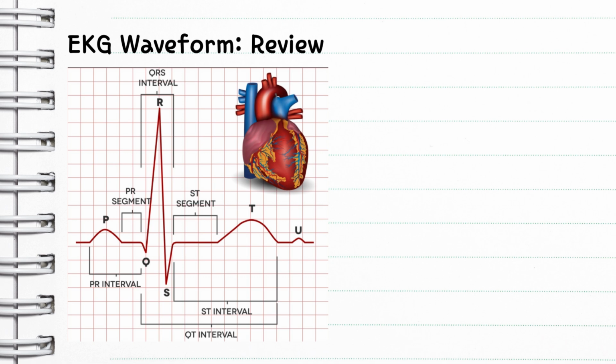And it's during the T wave that it's preparing for the next electrical jolt that will cause a squeeze and a contraction. A normal T wave is usually upright and just slightly rounded, okay? Abnormalities in the T wave can indicate issues with the heart's recovery phase, such as electrolyte imbalances or ischemia. Your heart muscle is super particular about potassium, but also other things too.